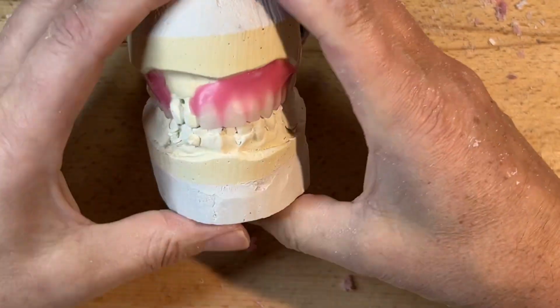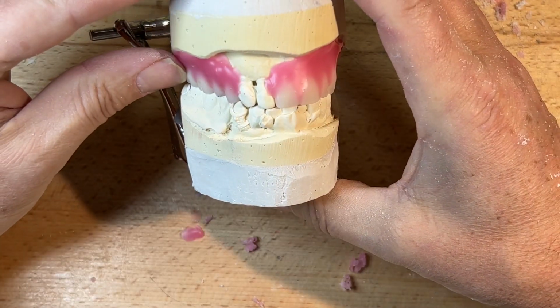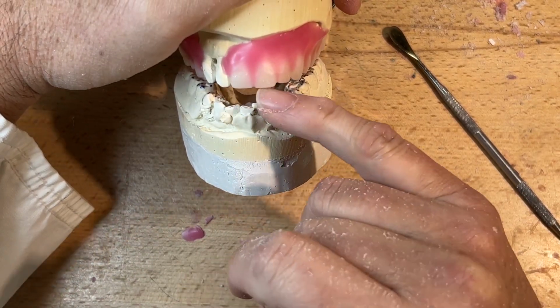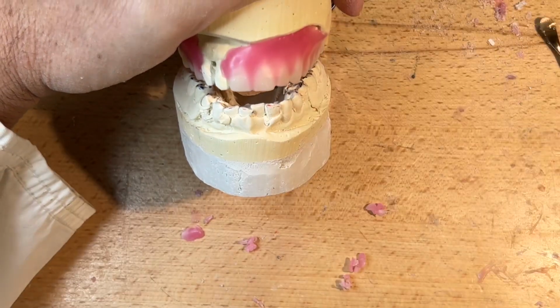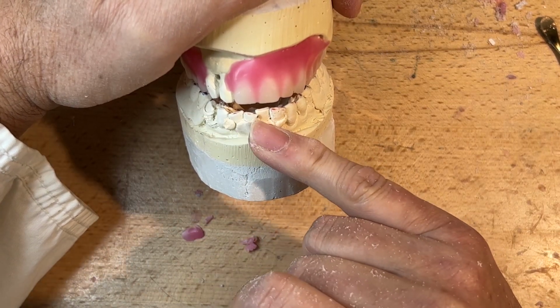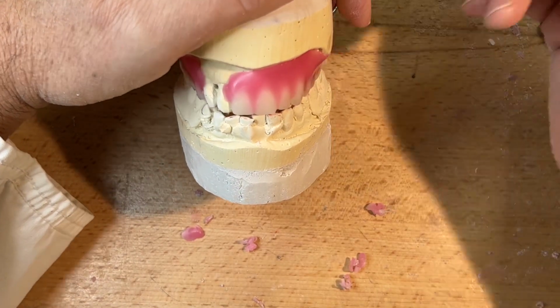And like I said, I'm going to double check here. I'm tight all the way around. These inverted centrals I may leave and do some customized grinding, and then go back up with the distal line angle of the 1 and 1. But we also have this angulation of the lower 4-1. So do you want to be symmetrical or asymmetrical to that? I'll leave that for chairside.